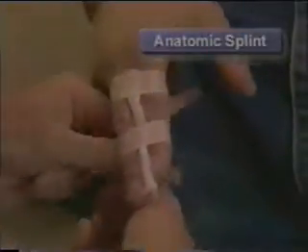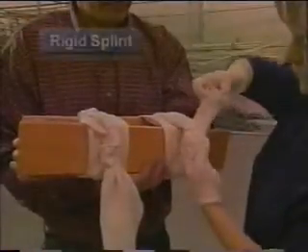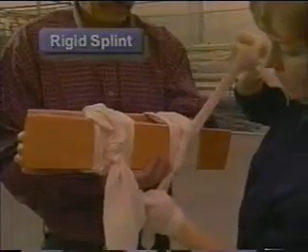A self or anatomic splint is one in which the injured body part is tied to an uninjured part. For example, an injured finger can be tied to an adjacent finger, or the legs can be tied together. A rigid splint can consist of a board, while a soft splint such as a blanket can be used to splint an injured ankle.